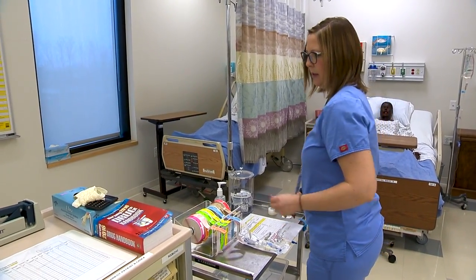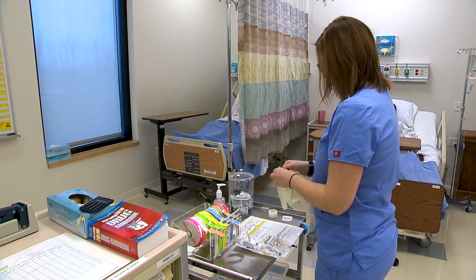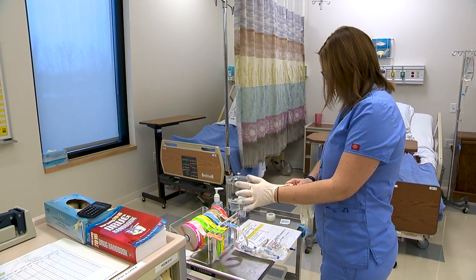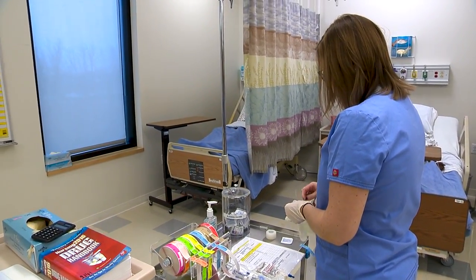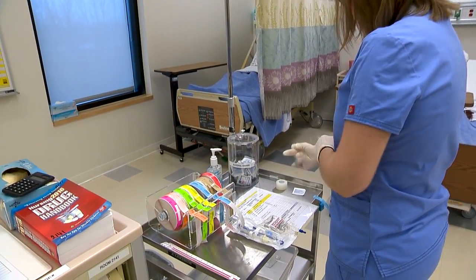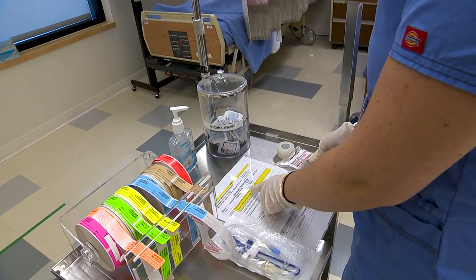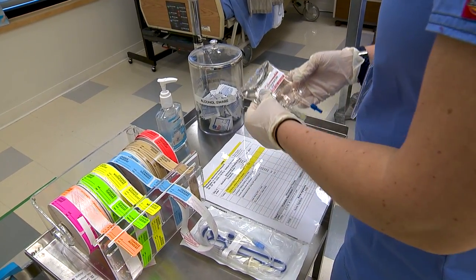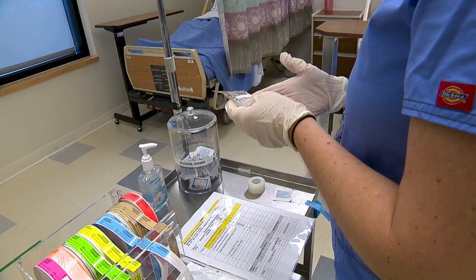Now I'm going to do my second check. I see I have Morgan Brown. I have ciprofloxacin 400 milligrams in 50 mLs to give IV piggyback today at 9 a.m. I'm inspecting my drug and it looks good.